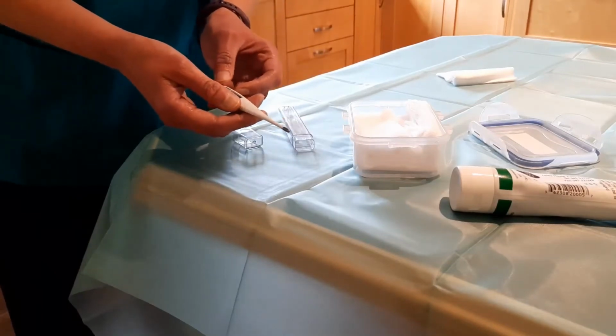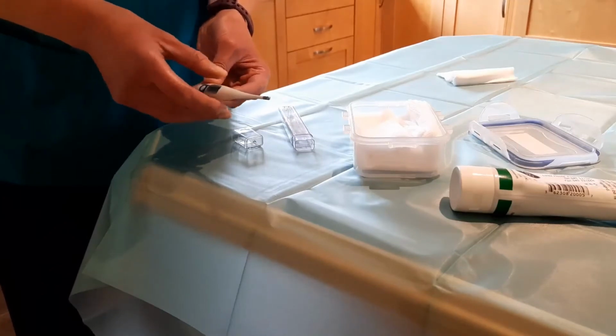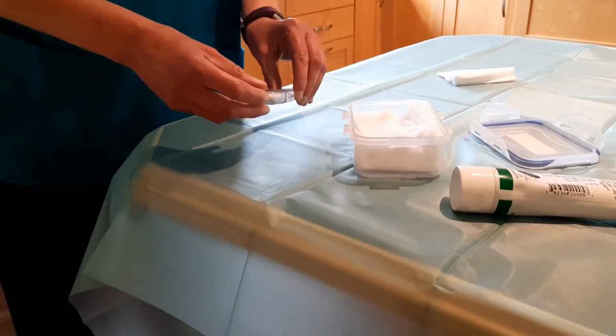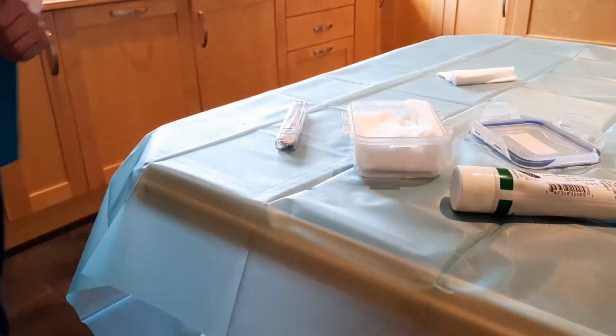Once you've removed the thermometer from the patient, again clean and disinfect the probe, switch off and put it back in its original case. You should also record the temperature straight away.